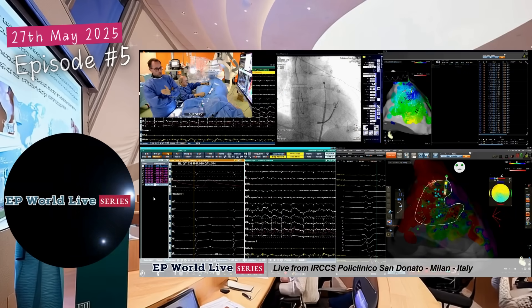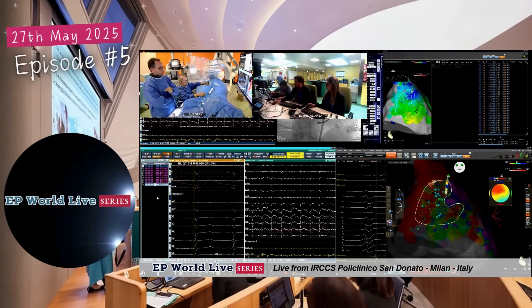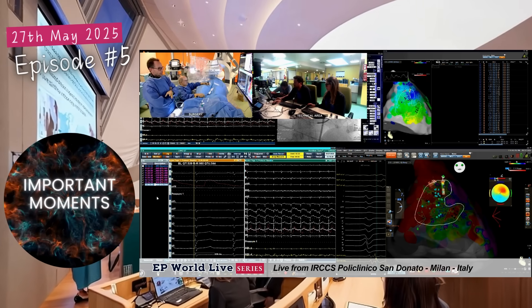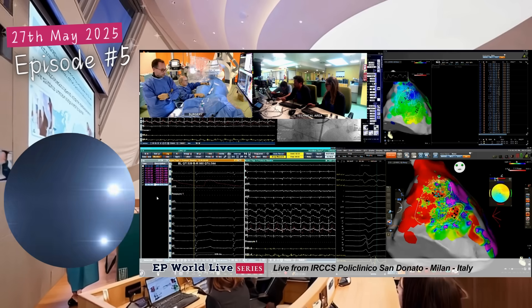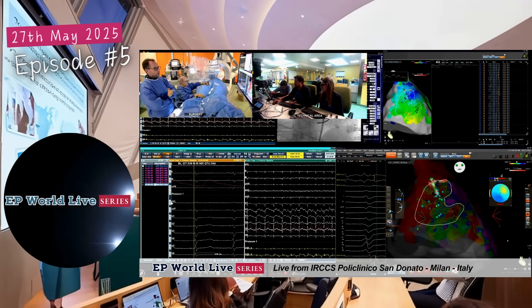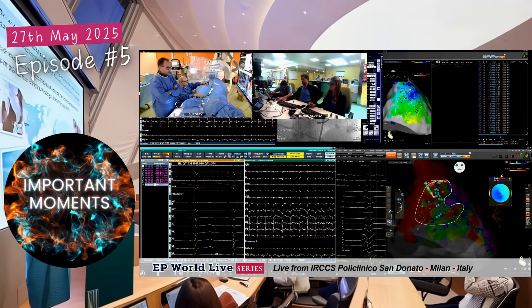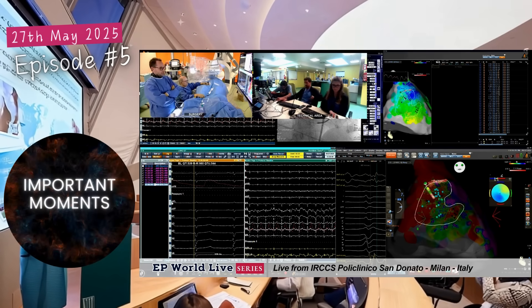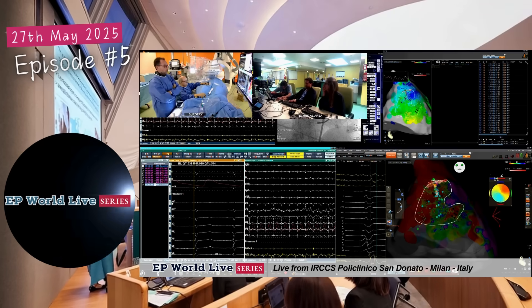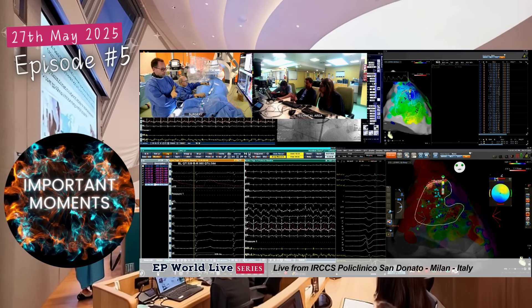Our endpoint is to achieve a shallow lesion — just to homogenize this epicardial substrate and not be transmural. To do so, we move the catheter every few seconds, so the ablation time will be very fast. It is sufficient like that; we don't need to prolong our stay at each point to avoid transmurality.